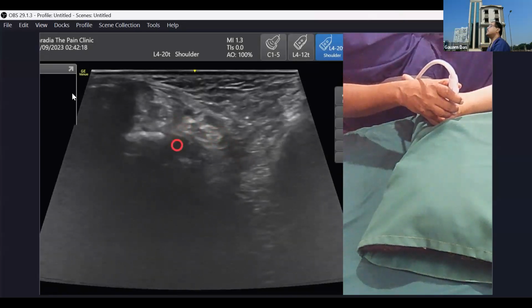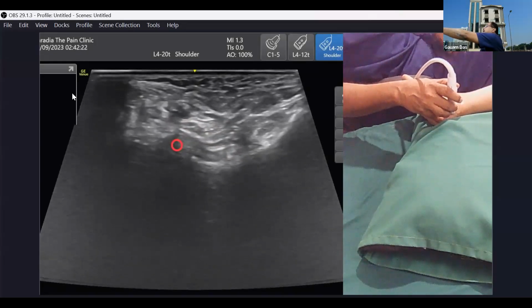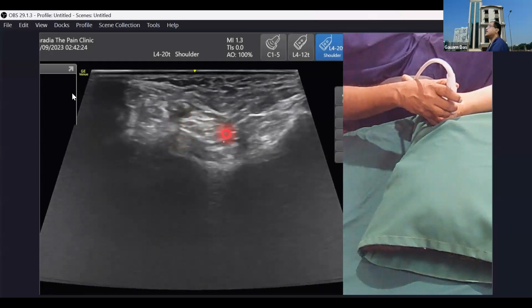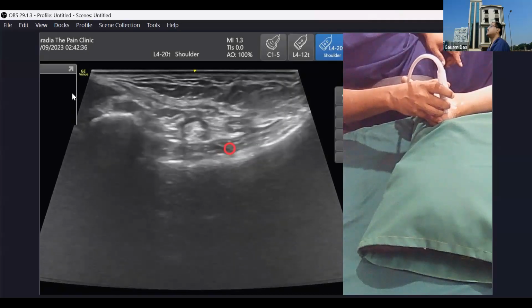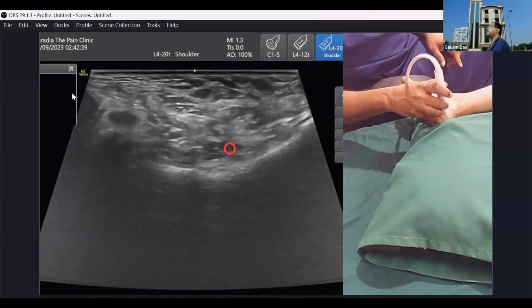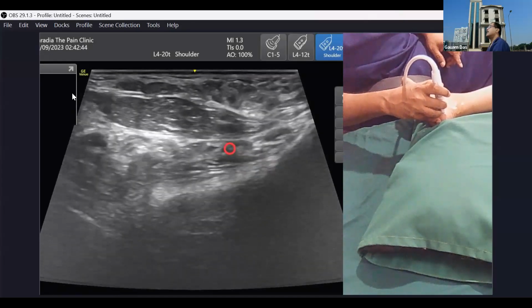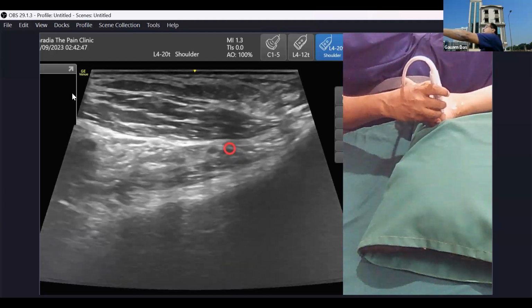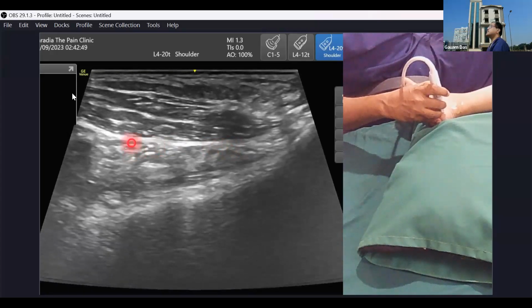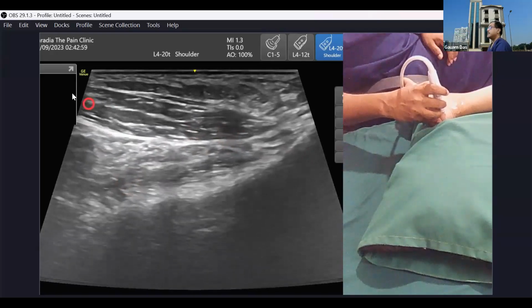And then if I'm going down, these nerves are getting divided. And now another branch which is appearing is your Baxter nerve or inferior calcaneal branch of the lateral plantar nerve. Follow this branch of the nerve. I'm coming down, and now the quadratus plantar muscle has started appearing, and also abductor hallucis. And in these, this is one nerve, lateral plantar, medial plantar, and here is the Baxter nerve. And here, this is your quadratus plantar. And this is your abductor hallucis.